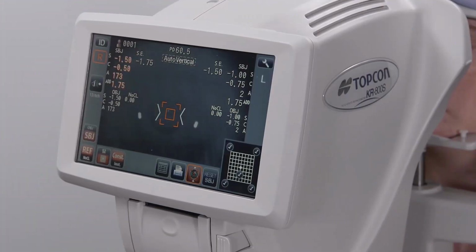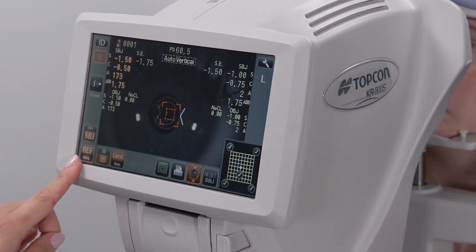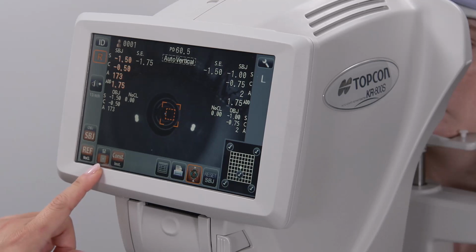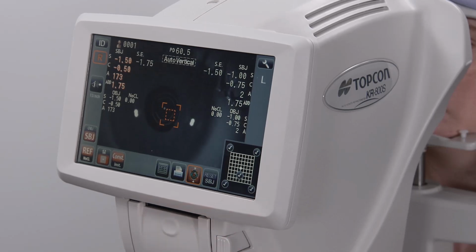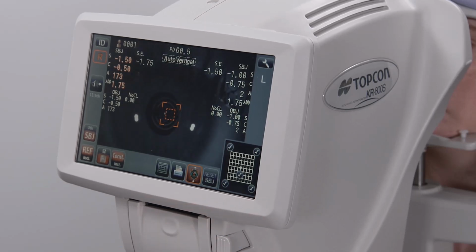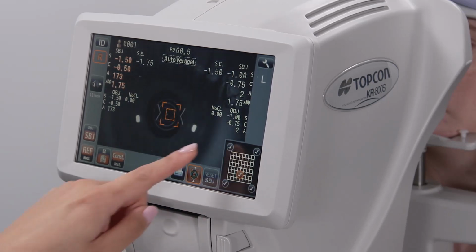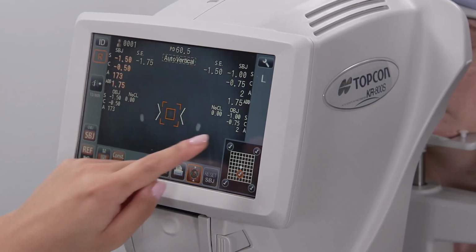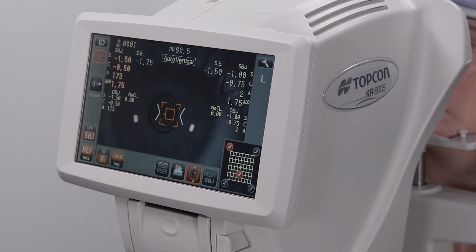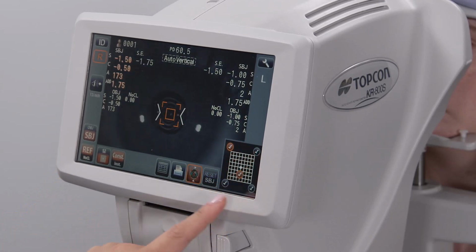To begin grid testing for macular degeneration, make sure that the lower left icon is set to ref for refraction and that the next icon shows the grid pattern instead of the vision chart. Note that a grid pattern with check marks will appear at the lower right of the screen. Have the patient look at the center dot and tell you if there's any distortion. If there is, select the central check mark. Then have the patient look at the upper left corner of the grid and ask about distortions. If they see a distortion, click on the upper left check mark. Repeat this process for each of the remaining corners.